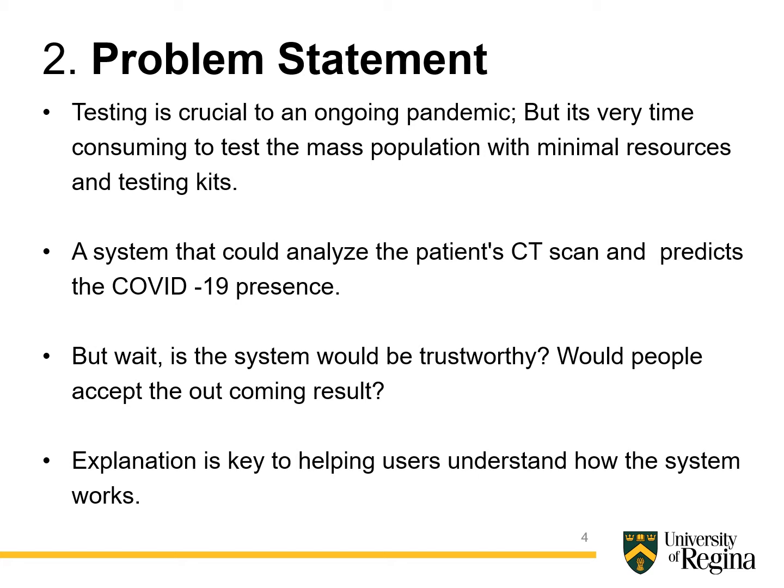A recent study shows that testing with CT scans and chest X-ray detected more cases in a very minimal time. For this, we need a system that could analyze patient CT scan and/or chest X-ray images and predict the presence of COVID-19 in the image.